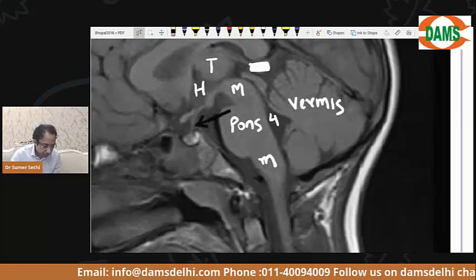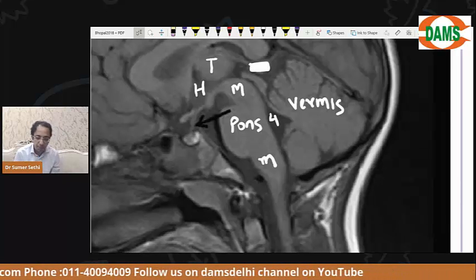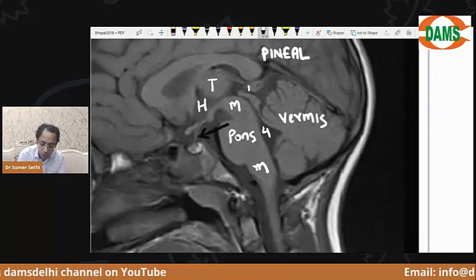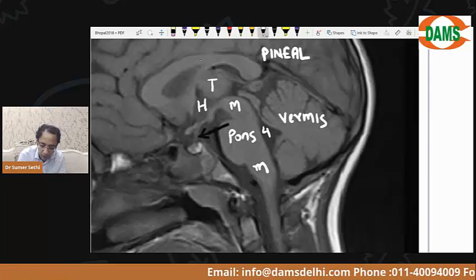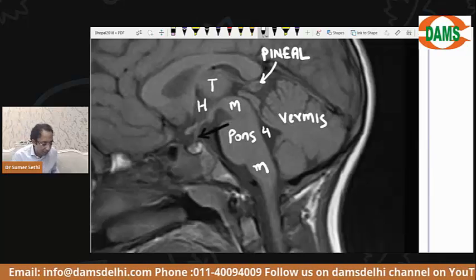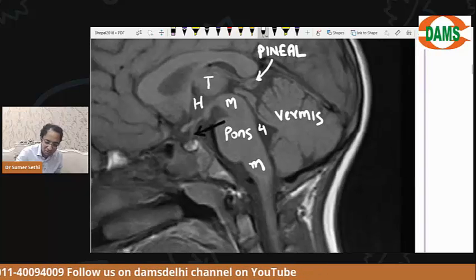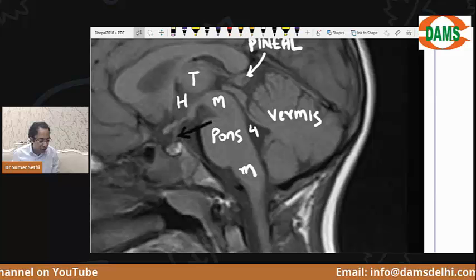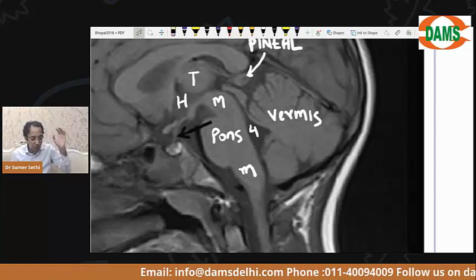Everybody understands? The arrow was at the pineal gland. I just showed you, this is the pineal gland. The black arrow, I will come back to that later. Listen to me first. Some people are always running to other structures. Look first at what I am showing you. Otherwise I will have to pull your ears. Look at what I am saying.